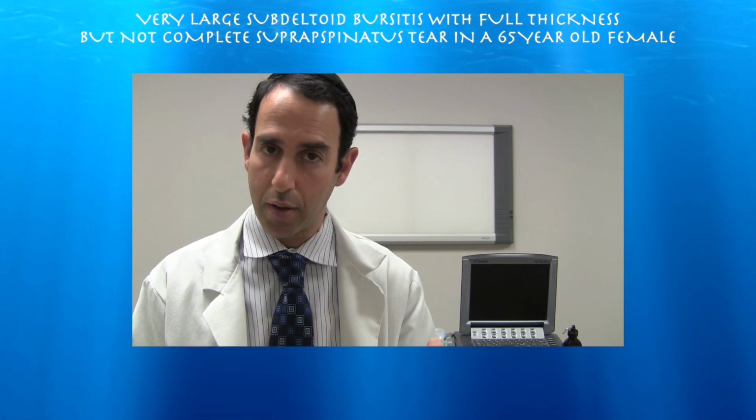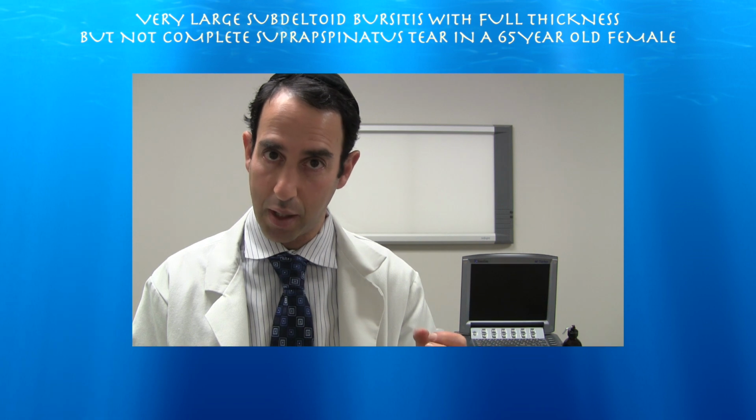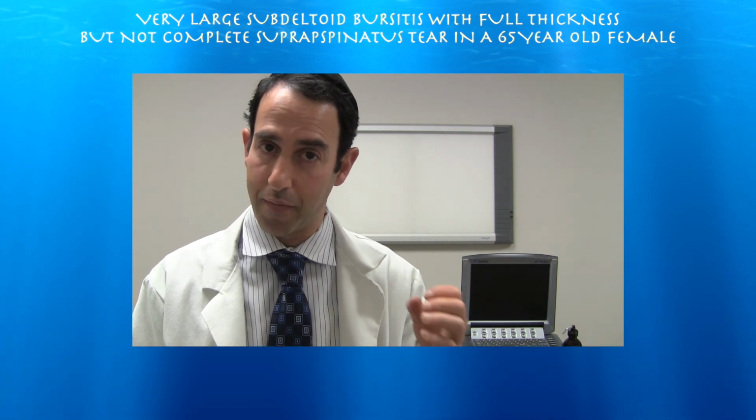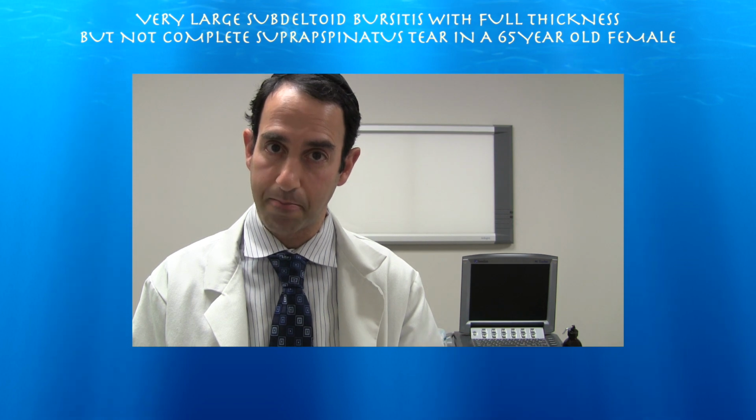So this is where ultrasound comes in very handy. We did an ultrasound which shows a full thickness supraspinatus tear, but not a complete supraspinatus tear. And what's very impressive is her subdeltoid bursitis, which is quite huge and heterogeneous.